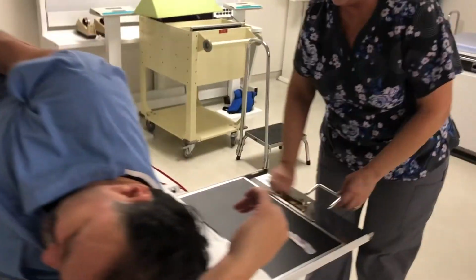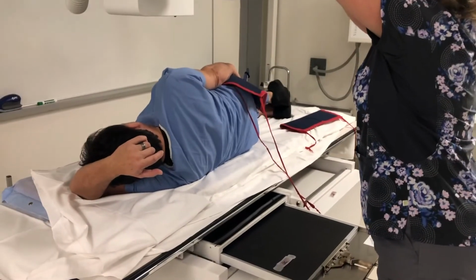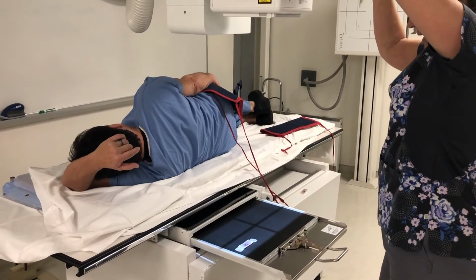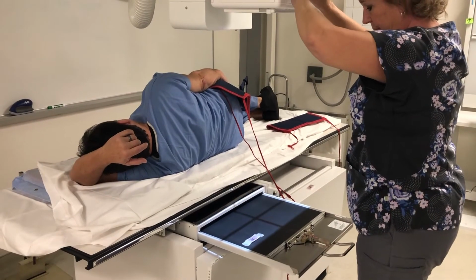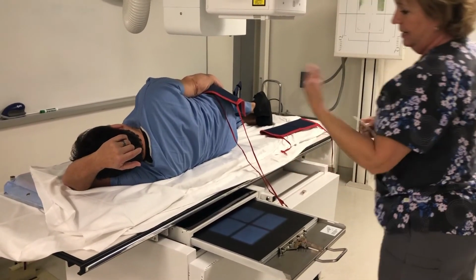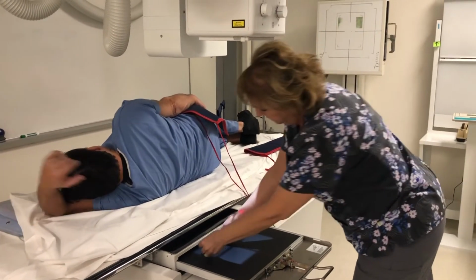I would have a 10 by 12 cassette, but in the interest of time here, I'm just going to collimate to a 10 by 12 because if you're on direct capture, you're not changing out cassettes anyway. You're just adjusting your field of view. So I'm going to be down roughly to a 10 by 12. He is on his left side, so I'm going to use a left marker.